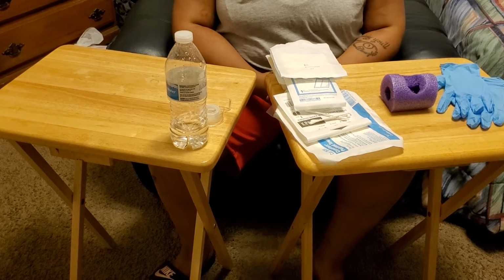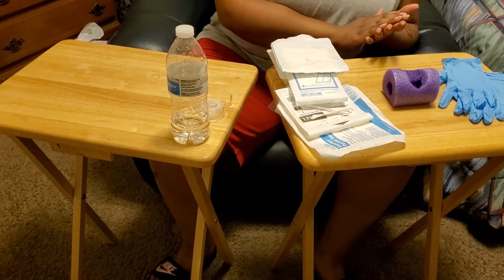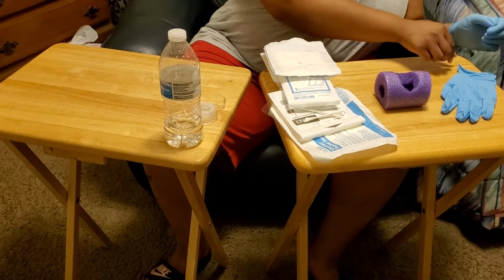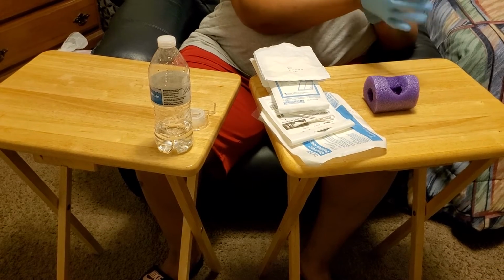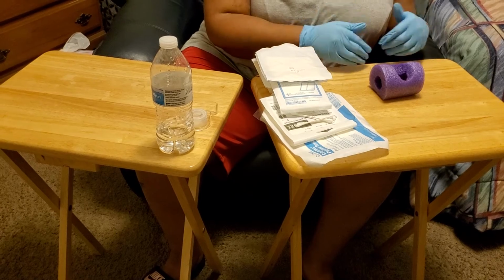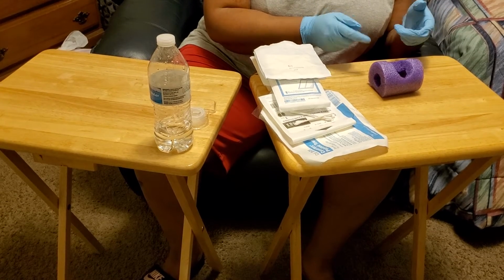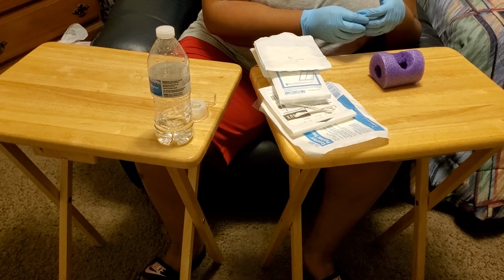So to begin my wound dressing, the first thing that I would do is wash my hands, and then I would put on clean gloves. Okay, when I put on the clean gloves, there would be a previous dressing on here, and I would take that one off. You take the old one off with clean gloves, just because it's already a pretty much contaminated area. Don't really need sterile gloves yet.